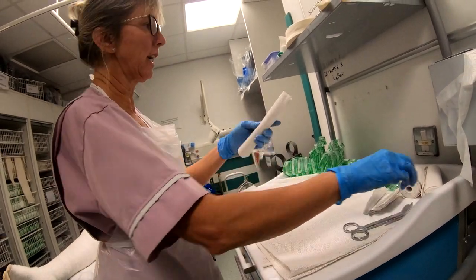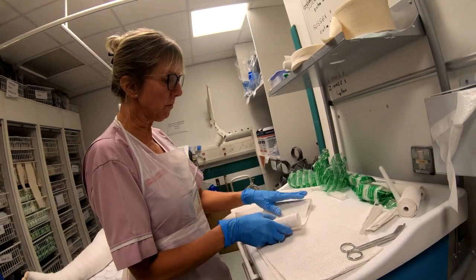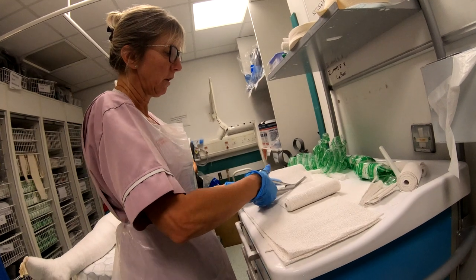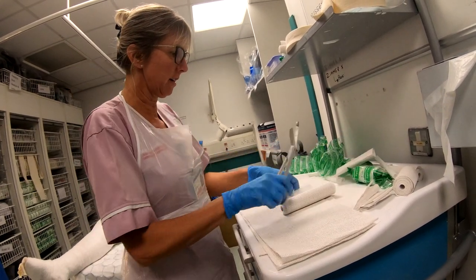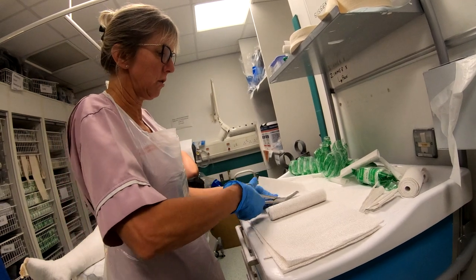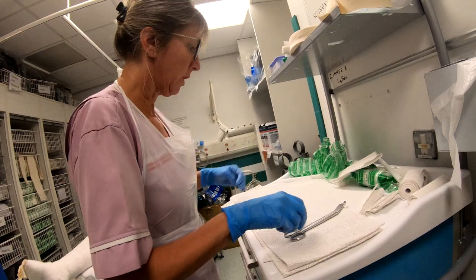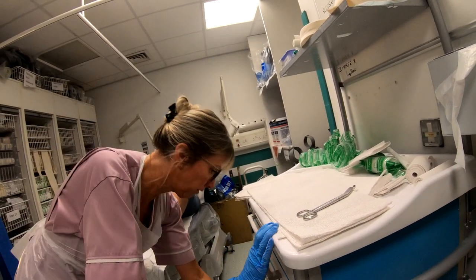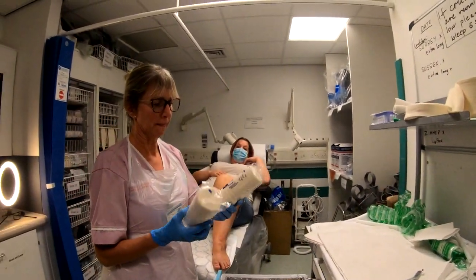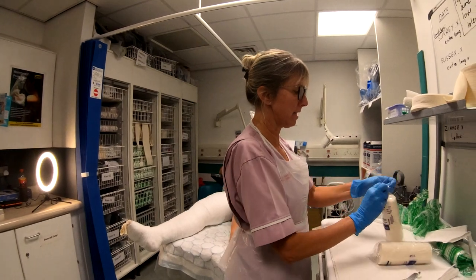We also need — not forgetting — two securing pieces, using the 15-centimeter plaster: one for the above knee and one for the below. And then we need a good couple of bandages, using the biggest ones. Definitely need two of those, so we're all set and ready to go.